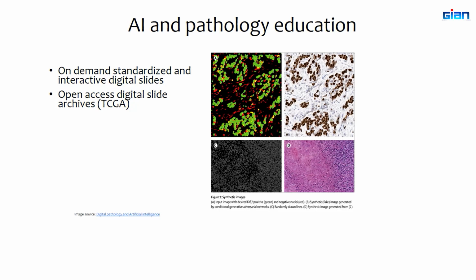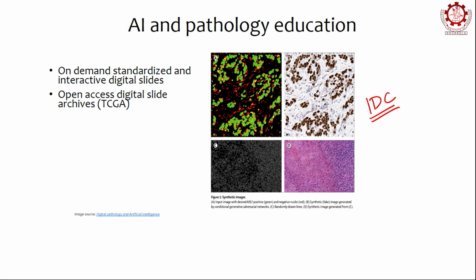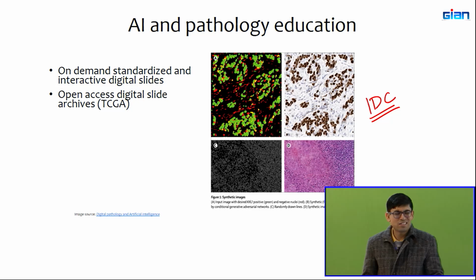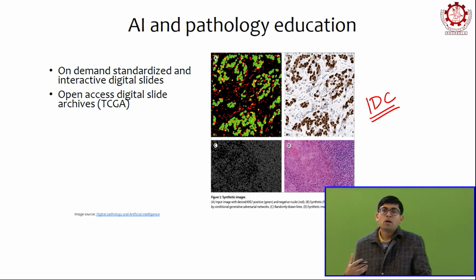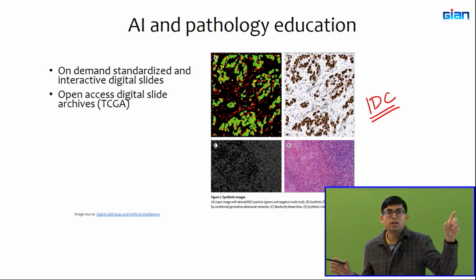So there is also another resource. I haven't noted it here, but I can write it down. Imaging Data Commons. So Imaging Data Commons is a relatively new initiative. I think it's been less than 5 to 6 years. So what you can do there is you can also upload your scripts. And when you upload your scripts, they do provide some compute. It can directly interface with TCGA or TCIA. You can pull images, run it on their system.